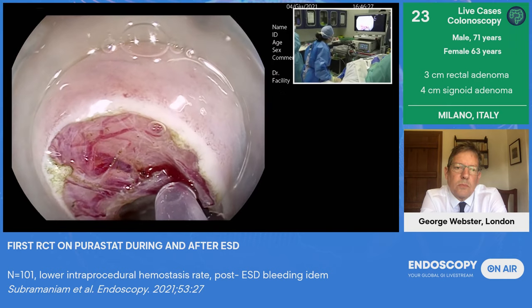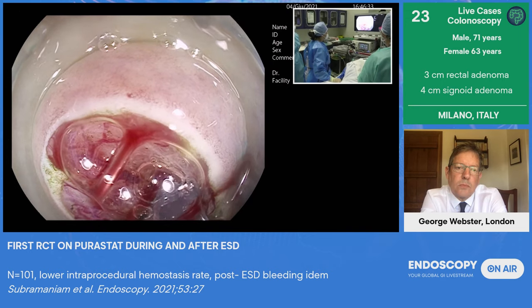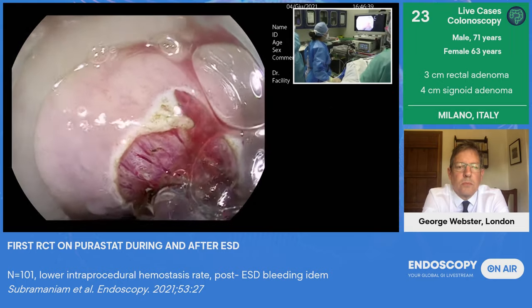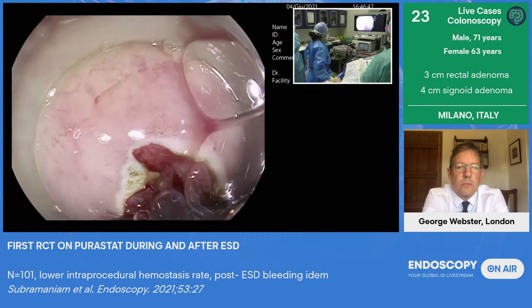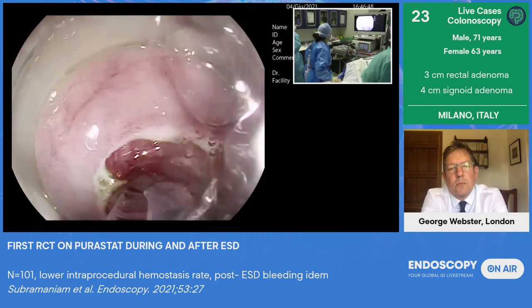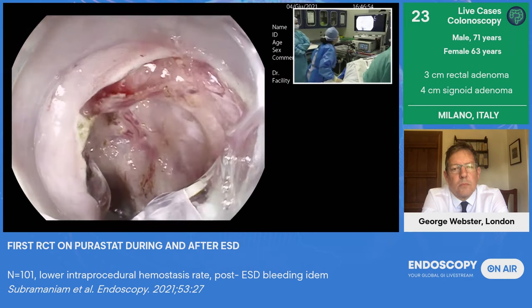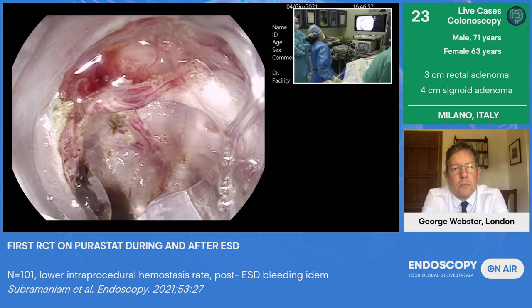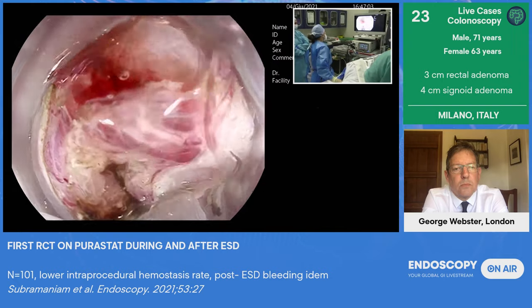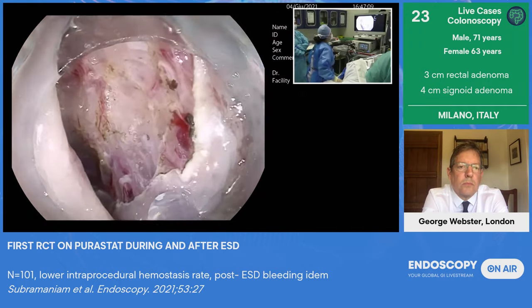Let's look at this small spurting vessel. I'm not inflating a lot of CO2 because otherwise, as I said, for the gravity, the Purastat will go on the other side. And the Purastat is this peptide that is transparent. So usually also during the procedure, you can apply it, stay, stop, just wait, it will help me for that small bleeding point. Not cleaning, not washing, not inflating or deflating on that side too much, otherwise you will remove the gel that you are applying.